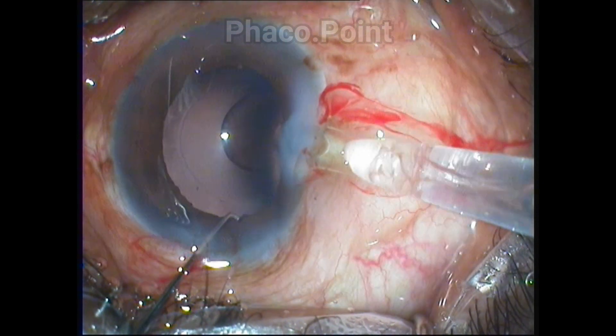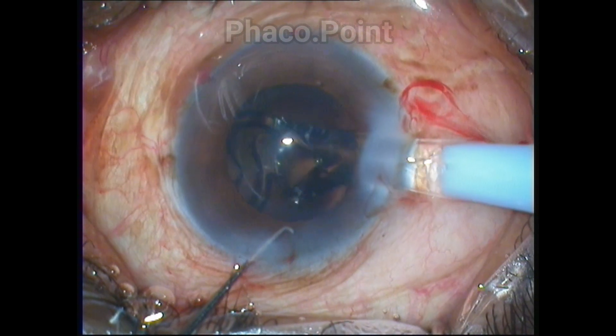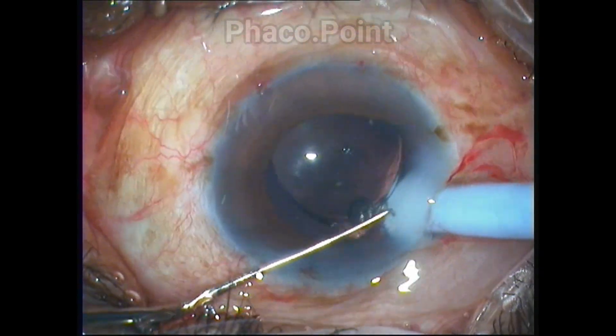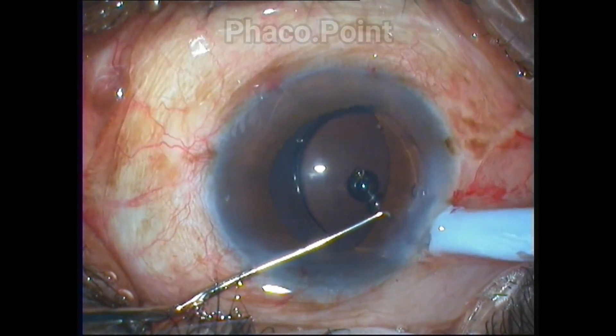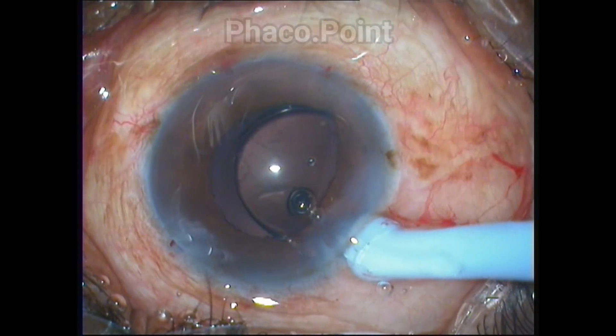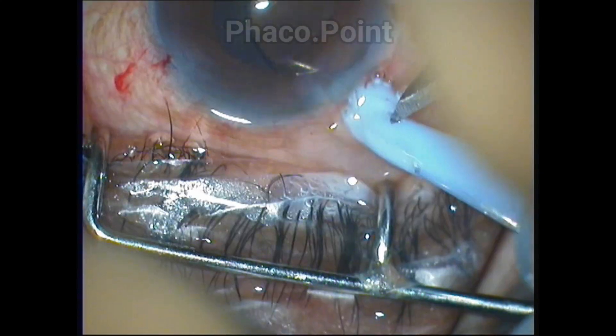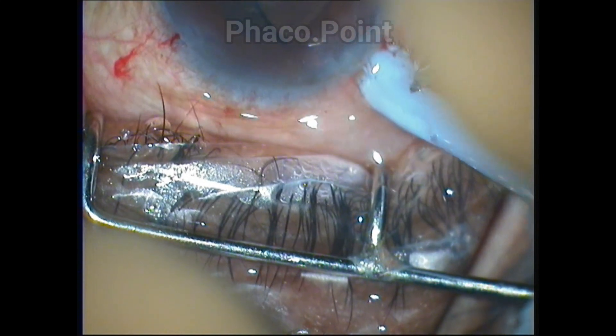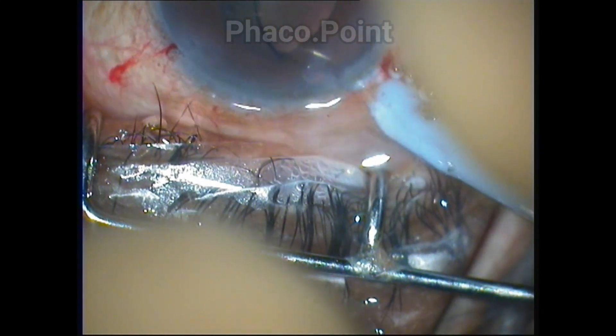The surgeon is about to insert the IOL and seems to be successfully doing so, but towards the end of IOL insertion, the surgeon actually notices that the trailing haptic is stuck between the plunger and the surrounding cartridge. The surgeon now, with the help of a plain forceps, gradually pulls the plunger out of the eye.